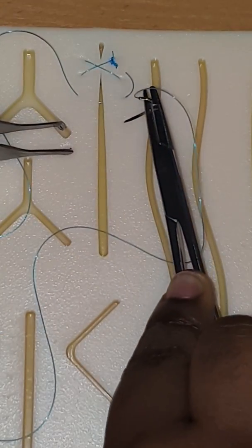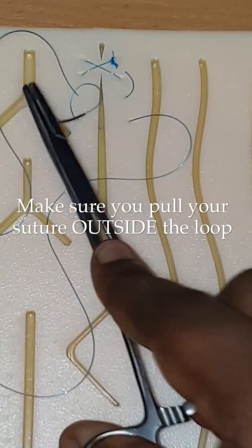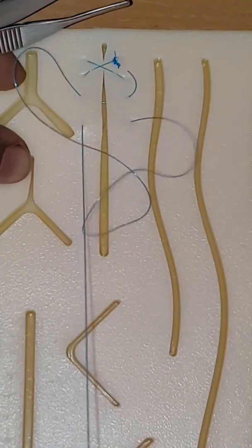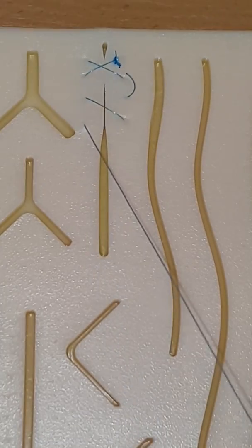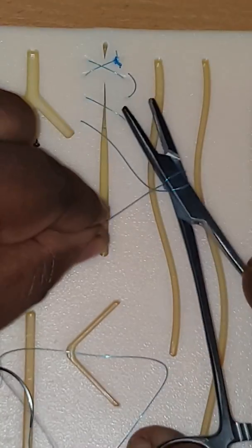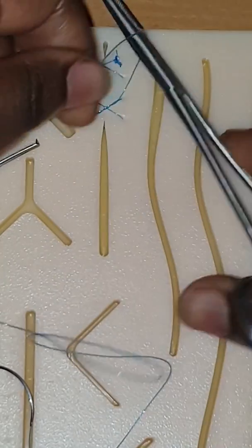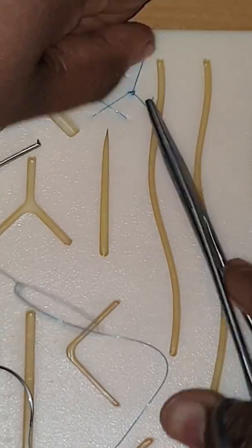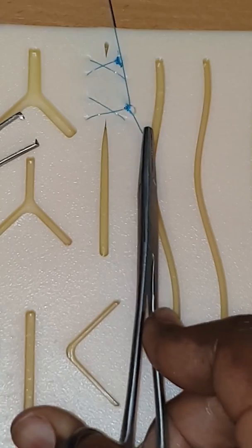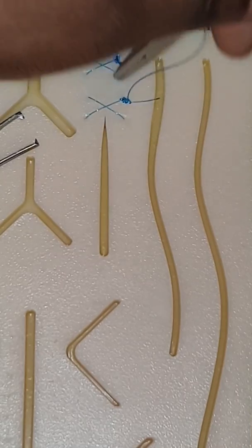Then we're going to start about five millimeters down and pull that through. Now we're going to tie these ends together: one, two — and once in the opposite direction, again opposite direction. Now we're going to cut.